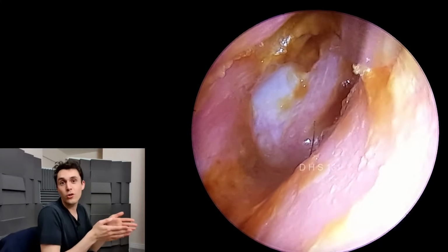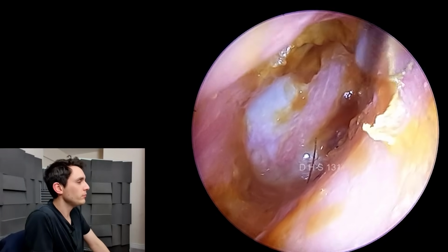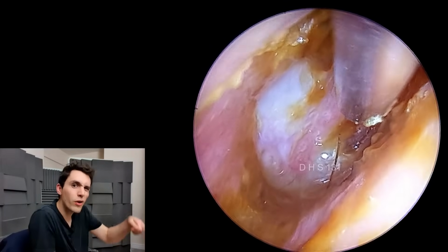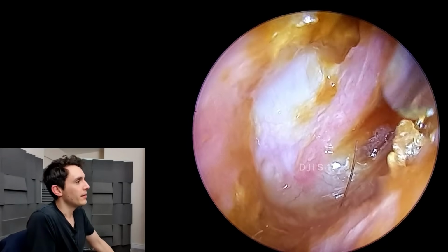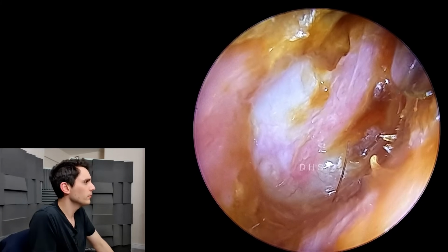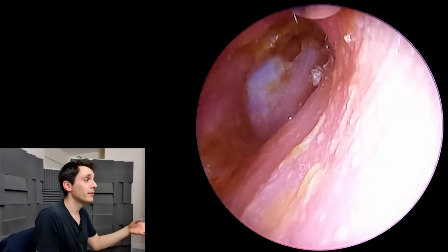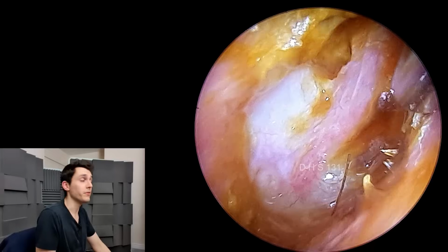So that creates a little bit of a cushion as I'm pressing the suction probe on the canal wall. That gives me some remit, but again, I can't dig it in there, if you know what I mean. I can't just scrape the suction probe against the wall of the ear canal. And again, very, very careful minimal pressure needed here. So again, I'm just trying to get these peels. And bacteria and fungi love to colonize and live on dead skin, which is called biofilm.